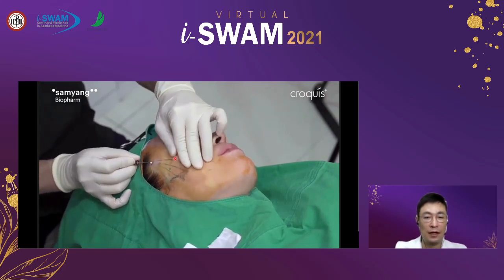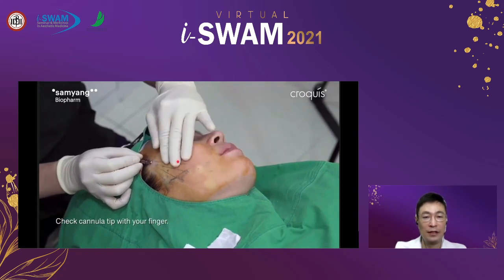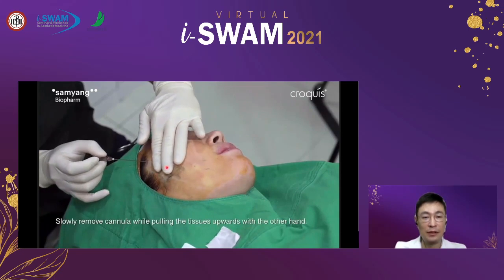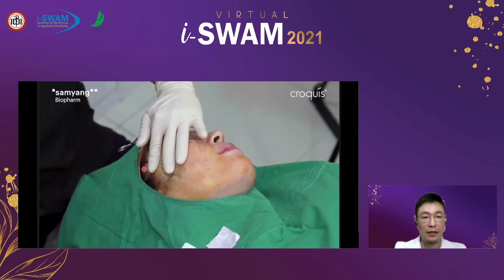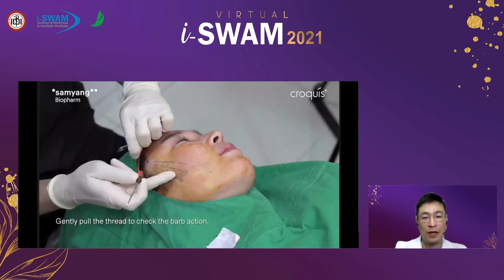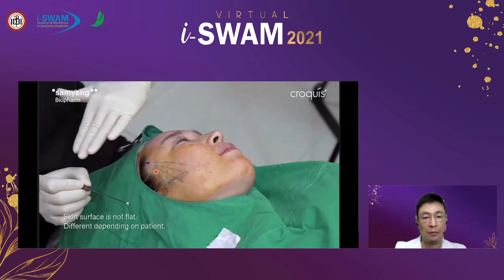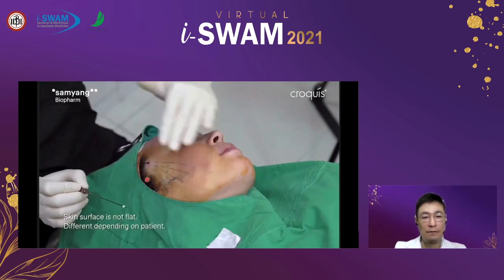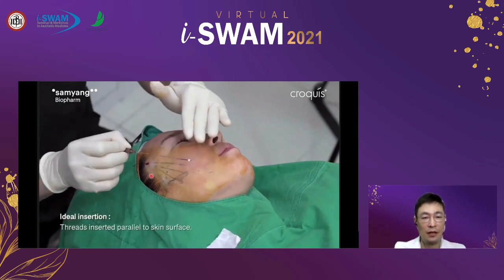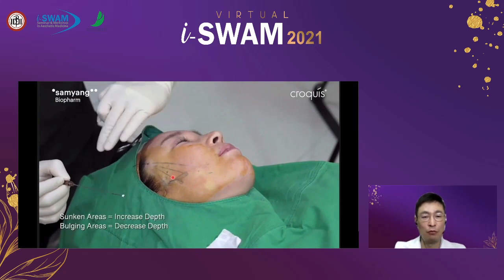In this area, there is usually a thick retaining ligament, which is the zygomatico-cutaneous ligament. When passing this ligament, you should advance your cannula a little lower than other pathways, because if the thread is located too superficially, after lifting, this sunken area may look worse.